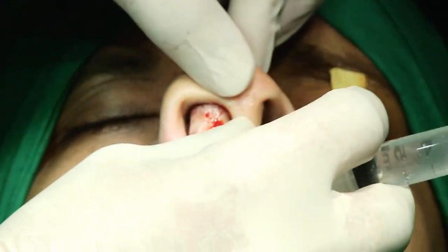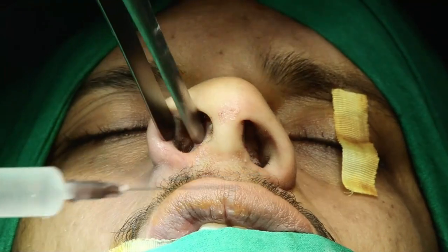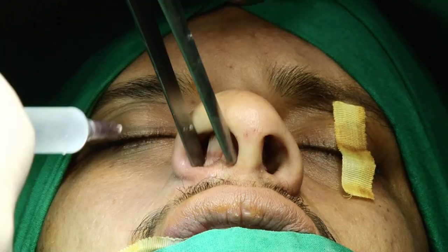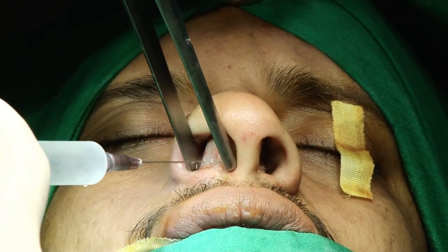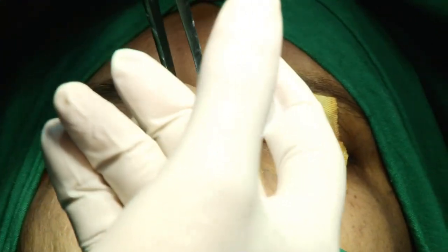Just come and twist it like on this side. This is the usual classical patient we find in the Indian scenario. So the septum is the main culprit. So we infiltrate, and we get a good ballooning.